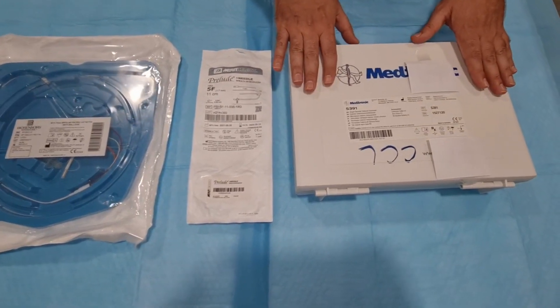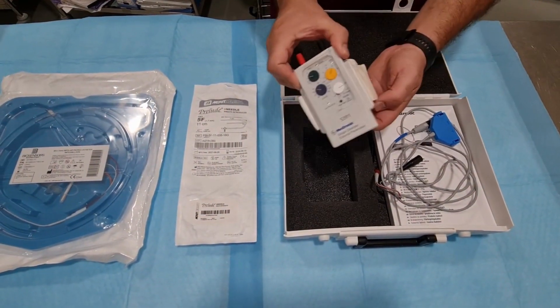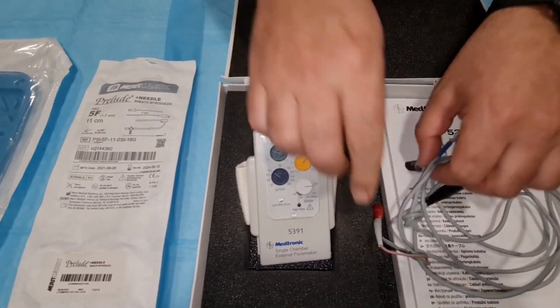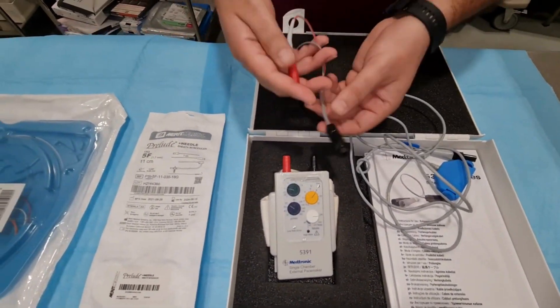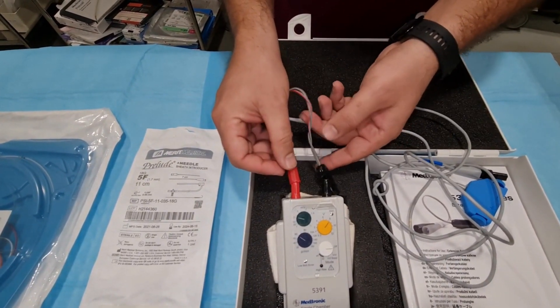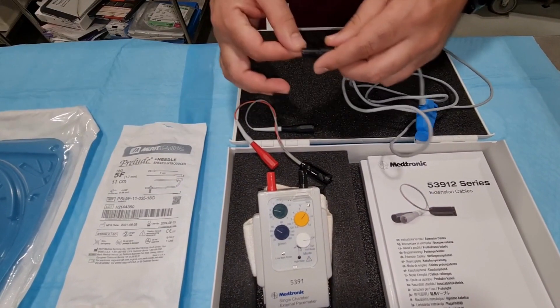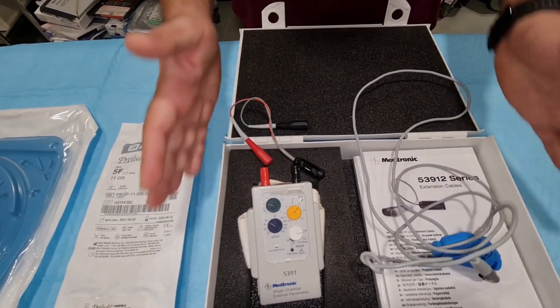This is the generator. This is the Medtronic generator we will use for the pacing purpose. This is the connection. We will connect it with this. Now, I will show you how to connect it with the TPM lead. These are the parts of the generator.